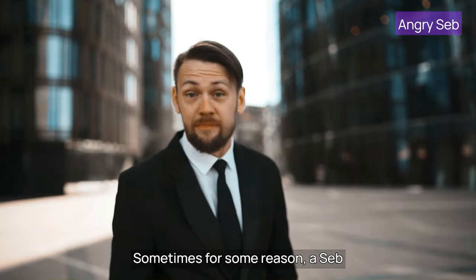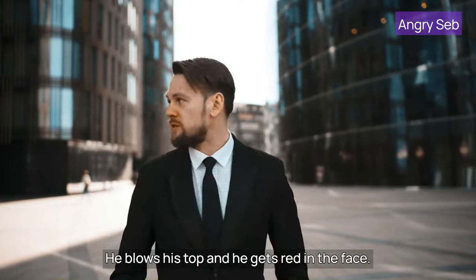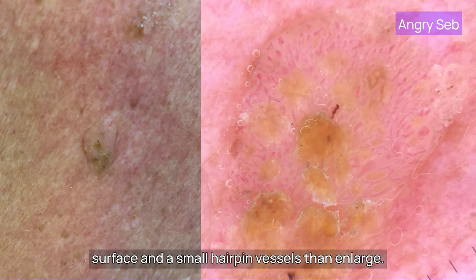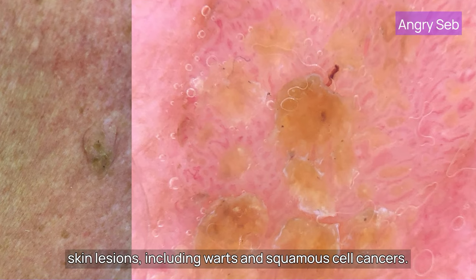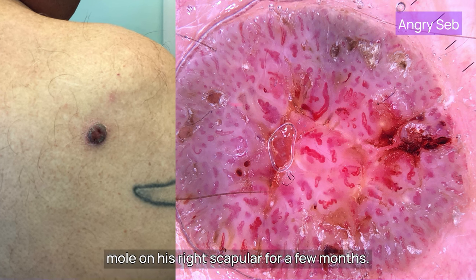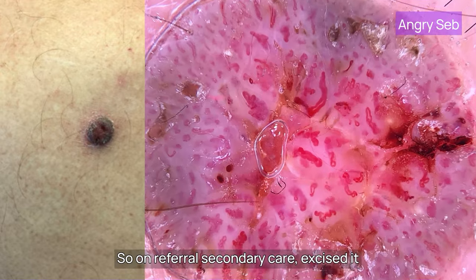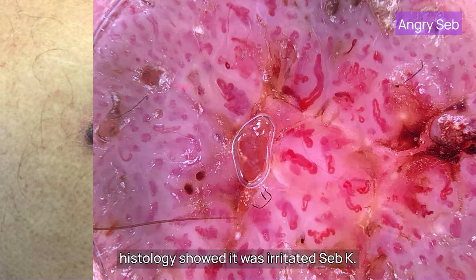Sometimes Seb gets irritated — I call this angry Seb. He blows his top and gets red in the face. An irritated Seb K tends to lose its keratin on the surface and the small hairpin vessels then enlarge. However, hairpin vessels are found in other keratinizing skin lesions including warts and squamous cell cancers. This gentleman presented with a changing mole on his right scapula for a few months. An SCC was a possible diagnosis, so on referral, secondary care excised it. Histology showed it was an irritated Seb K.